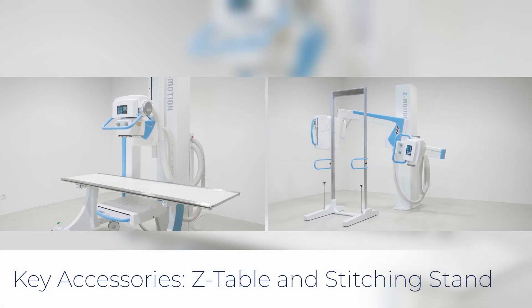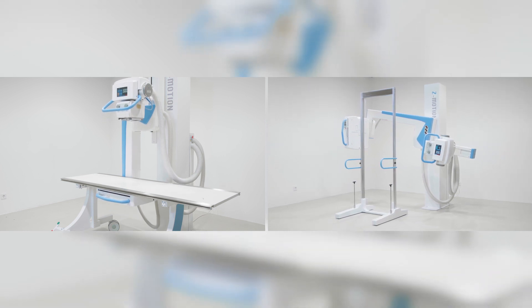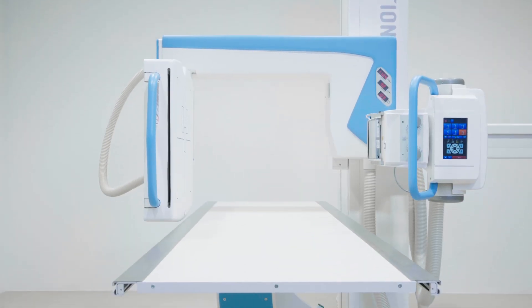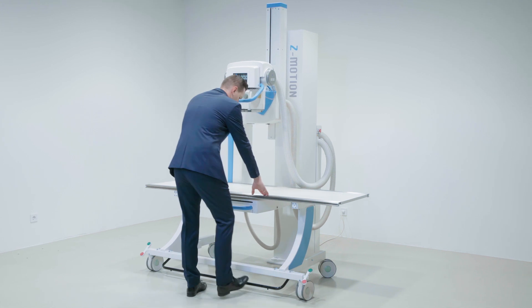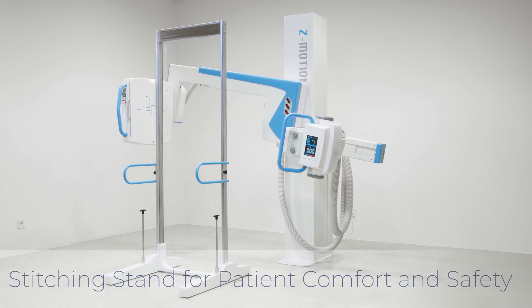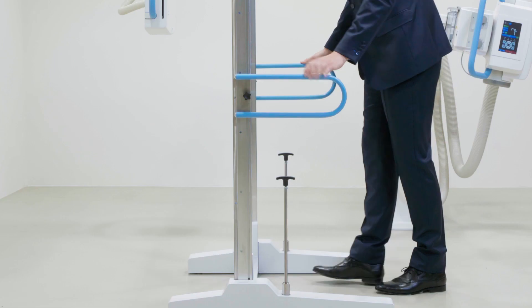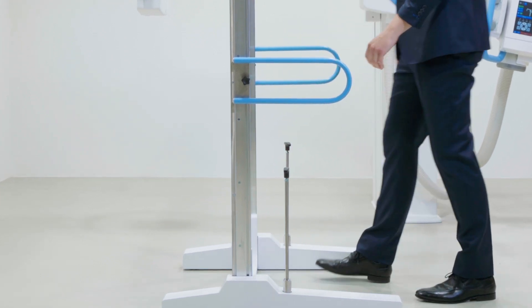The configuration is rounded off with two key accessories: the Z-table and the stitching stand. The Z-table is optimal for lateral exposures with a short source image distance. It is portable with large casters to ensure easy maneuverability. Its four-way radiographic table has mechanical brakes so there is no need for a power cord. The stitching stand is recommended to reduce patient movement and achieve optimal image quality. Its use contributes to high patient comfort and safety, and the stand's handles are adjustable with easy maneuverability on four casters.